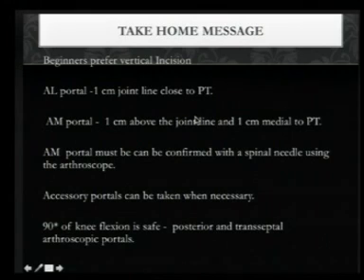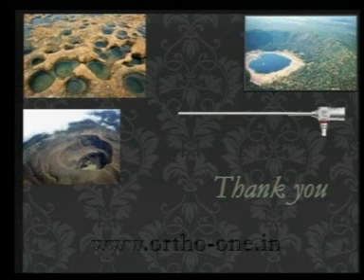The take-home message, therefore, is that as a beginner, it's much better to establish a vertical incision. Anteromedial portal, you find out what actual surgery you're going to do, pass the needle, and make sure you don't violate the articular cartilage, and then establish it as necessary. And you can make accessory portals as many as necessary. And 90 degrees flexion is the most safe position in which you can establish posterior or transseptal portals. Thank you.